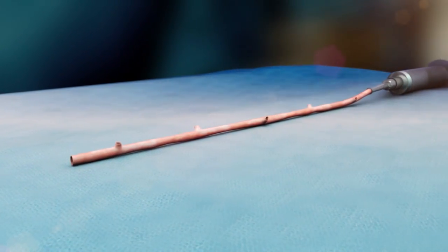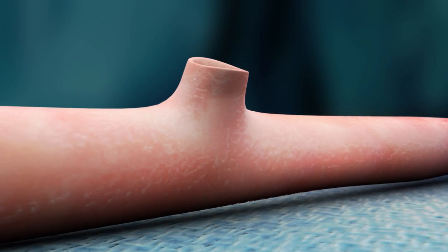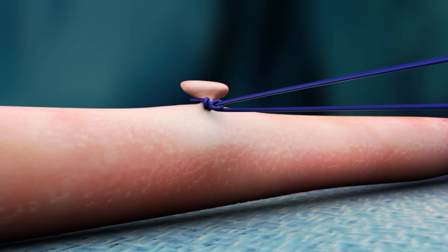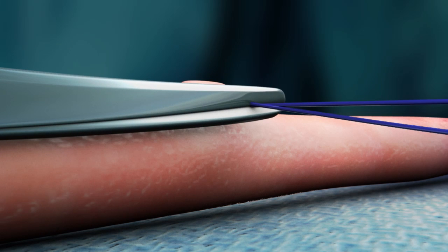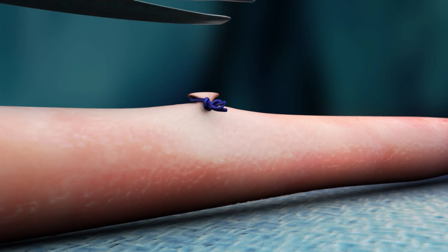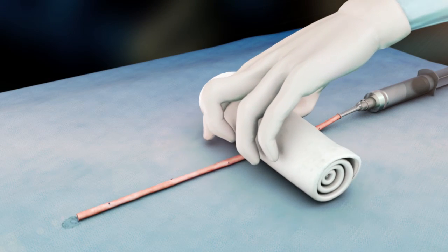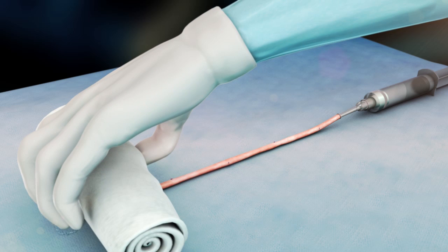After the targeted saphenous vein has been harvested, all side branches must be ligated using small diameter sutures such as 7-0 proline. Ligation clips cannot be used as they interfere with the deployment of the mesh over the vein. Gently inflate the vein using heparinized saline to check for any leaks. Carefully remove any excess fascia or adipose tissue from the vein. After all side branches have been ligated, gently evacuate the vein lumen of all air and fluid.